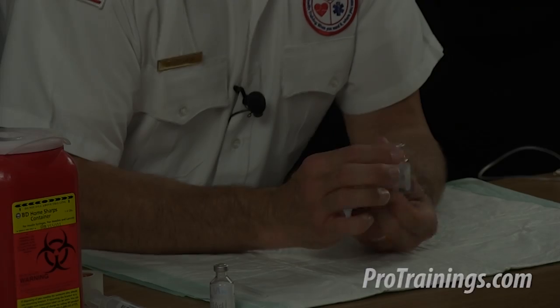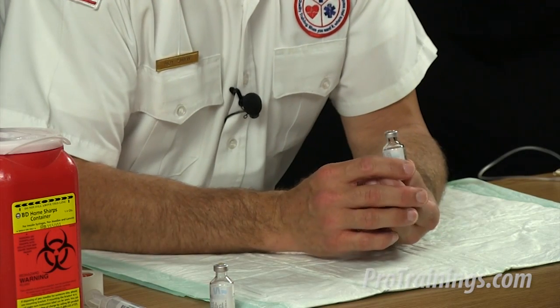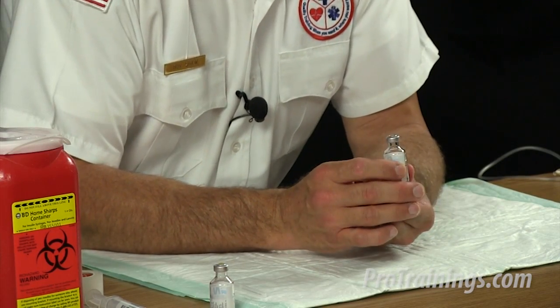Consider a syringe or a needle cannula contaminated once it's been used to enter or connect to a patient's intravenous infusion bag, or the administration set as well. Single-dose vials for medication should always be used whenever possible. Do not administer medications from single-dose vials or ampules to multiple patients, or combine leftover contents for later use.